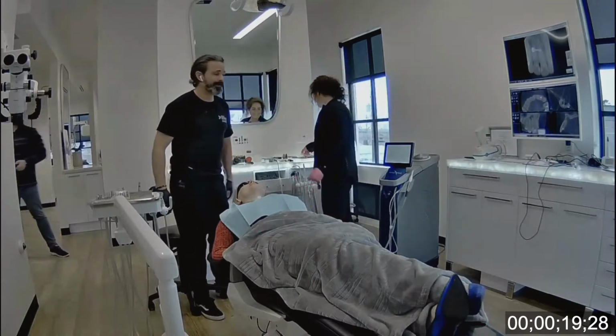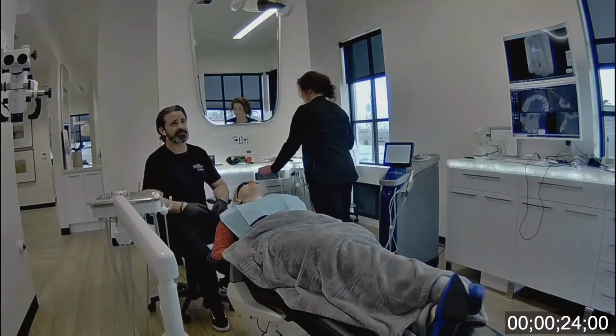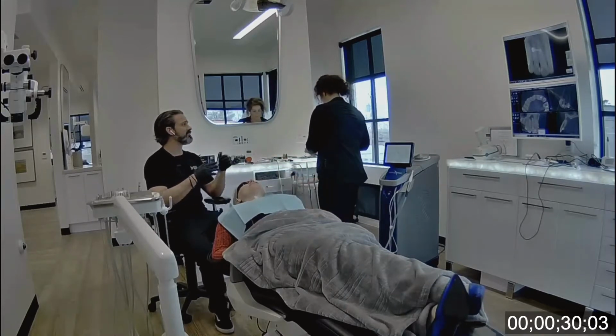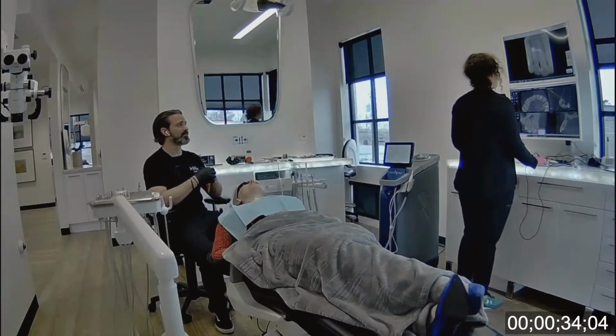We're going to do a root canal on tooth number 7 right now. Just real quick, the diagnosis is pulp necrosis with chronic apical periodontitis. Lindsay, if you want to go full screen with the x-ray, we'll take a look at that. This x-ray? Yeah, we'll start with the 2D.